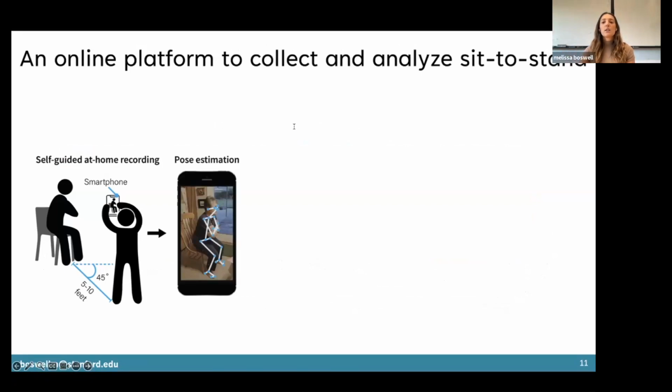The video is then uploaded to the cloud, and a pose estimation algorithm detected the joint locations, or the key points, in each frame throughout the movement. We did some additional data cleaning and processing on the results of these out-of-the-box algorithms, which I'll share now. So we used the software from the Fast Forward Moving Picture Experts Group, or FFmpeg, for extracting frames. And then we used OpenPose as our pose estimation algorithm. And if you stick around for part 2, I'll share how you can actually use other pose estimation algorithms.